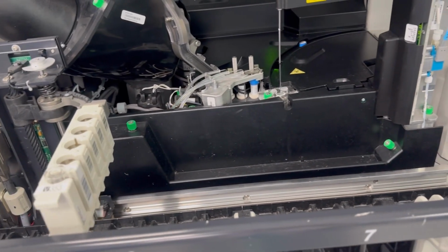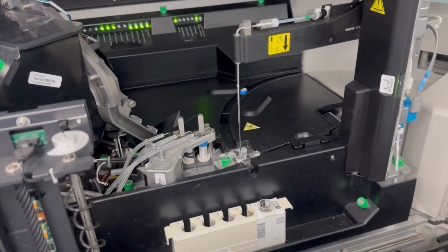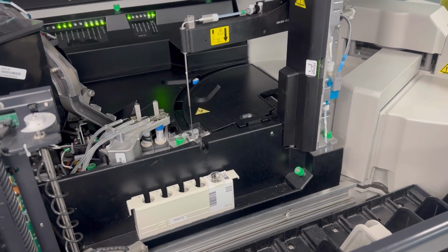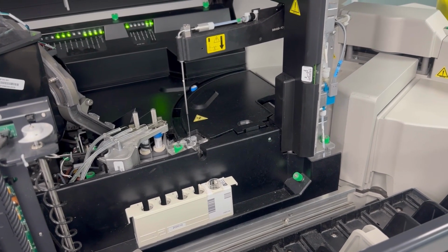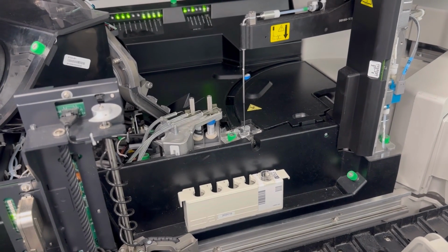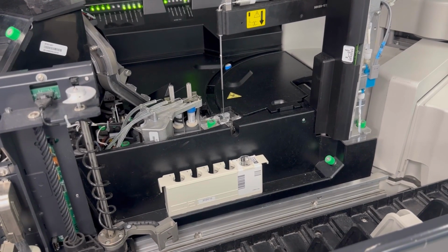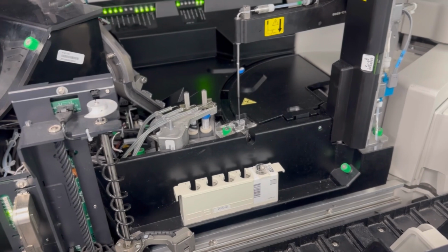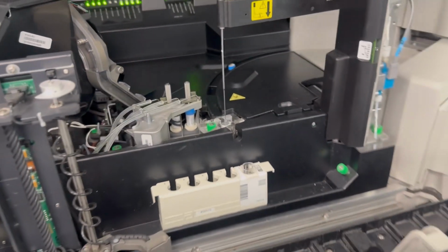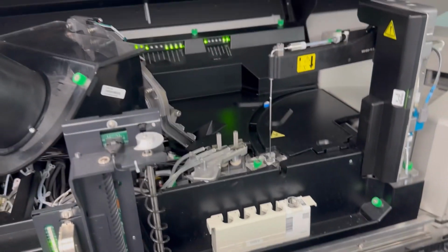Okay, this is how. And now you are seeing this one is for the hormone machines. For hormone machines, this is the probe. For hormone machines we are using the RVs to mix with this one. Here the probe will work. Now you can see first the machine will set itself, then here it will aspirate the sample from the probe. For this probe, both in the biochemistry and hormones, we have a probe cleaning solution also, which we need to give to make the probe work smoothly. It's like a lubricant for the probe.